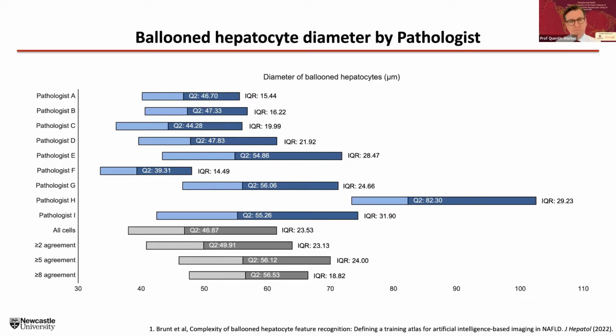We wondered if this was simply related to cell size, and certainly there is some indication that cell size matters. So pathologists here shown in red, who were willing to look at smaller cells and consider smaller cells to be ballooned, tended to see more balloon cells, whereas pathologists such as the one shown in amber, who tended to only consider very large cells to be ballooned, tended to see fewer balloon cells. So size is one part of the story, but it's probably not the entire story, and there may be more to that.